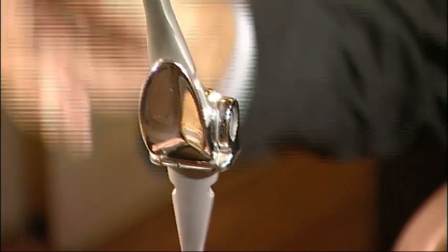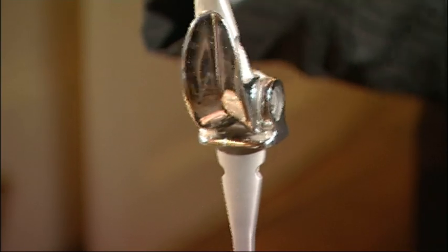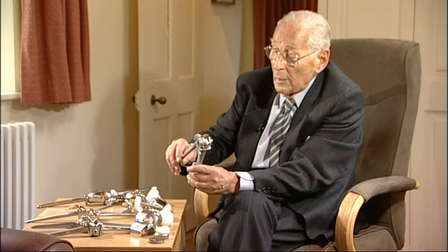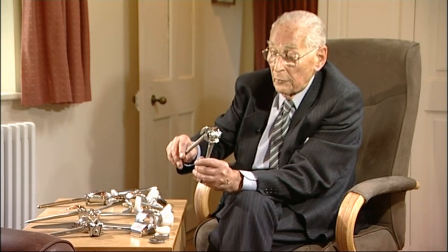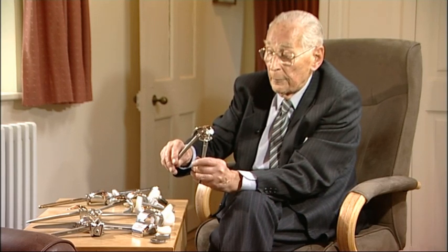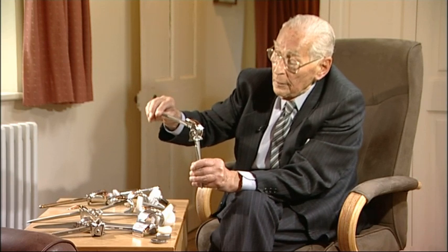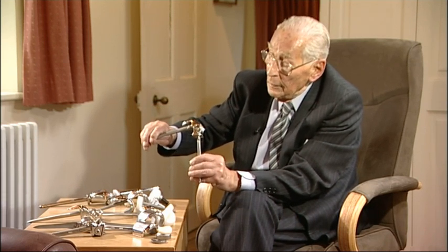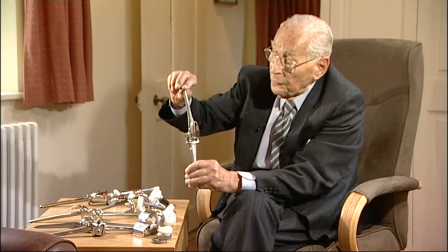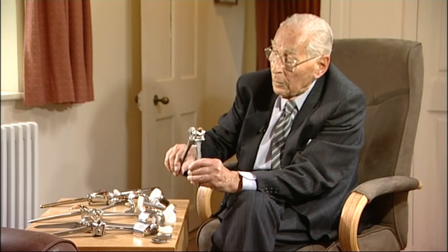It has to be cemented into position, but it does permit a rather freer range of movement than the earlier joints. There is the potential for almost 150 degrees of angular movement to occur in the knee. It also has a polyethylene spacer, so that the articulation is not of metal on metal, but it's of metal on polythene.